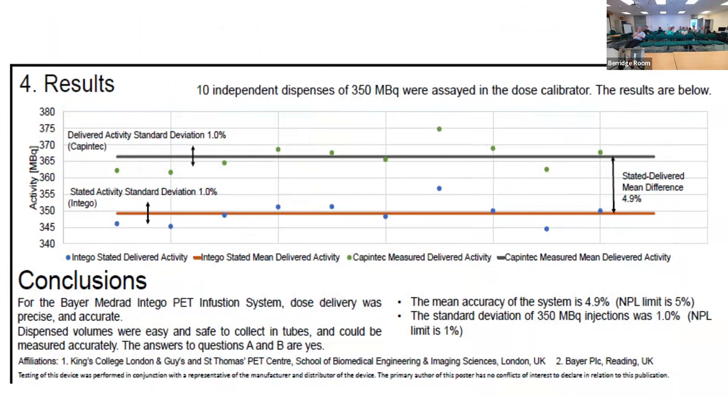That shows that when you are implementing something for clinical use, especially with PET-CT, which is also a quantitative system, controlling the accuracy of what you implement is not as easy as it may seem, and it can have an impact on the clinical aspect.